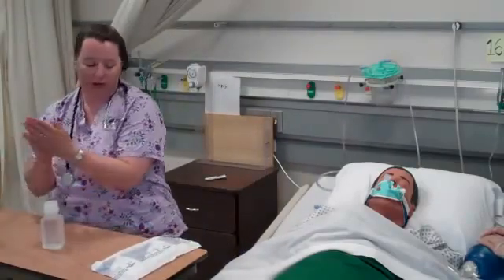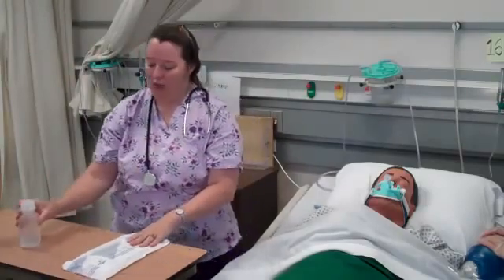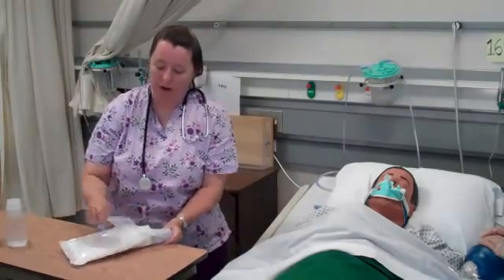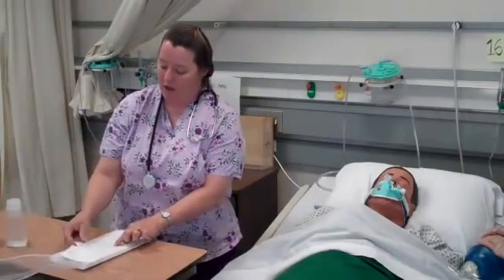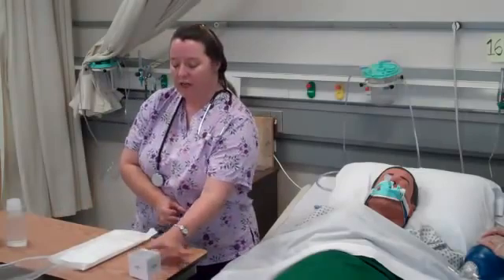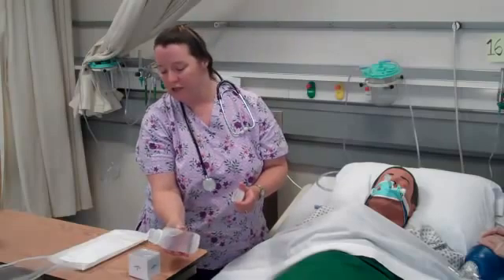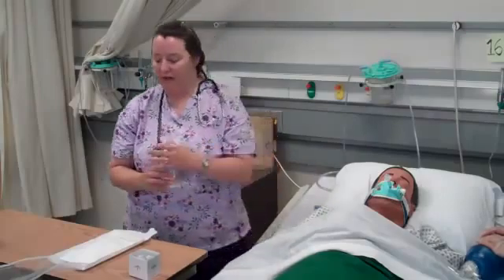I'm going to go ahead and wash my hands and get my equipment ready. Opening up the packaging, making sure it's opened correctly. This kit comes with a small cup for the saline. I'm going to open it up using sterile technique — not touching the inside — and pour the saline without touching the lip of the bottle to the container. Saline is now ready.